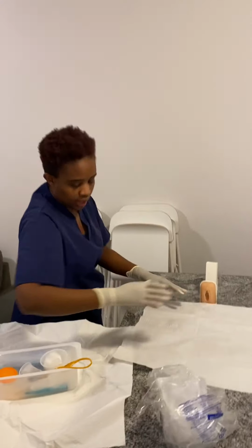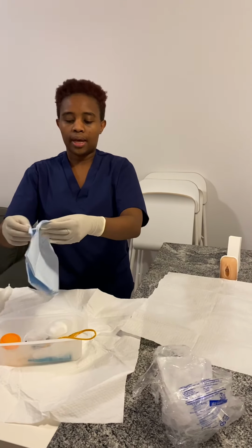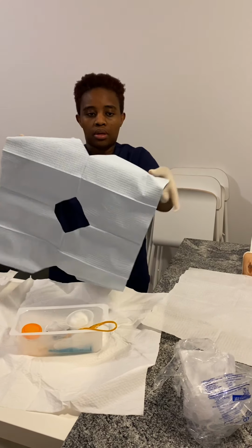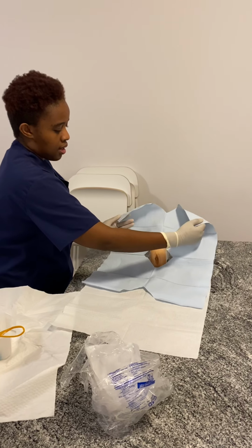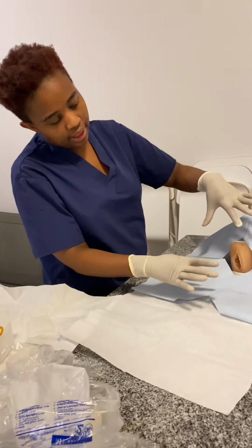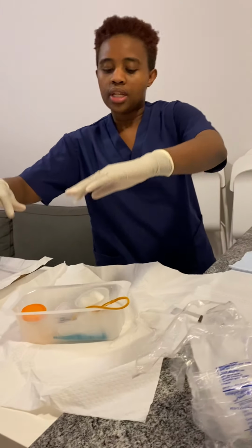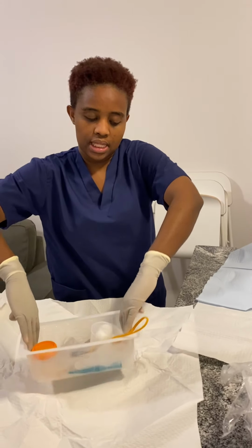Okay. And then I'm going to use the fenestrated drape, and I'm going to put it on top. Again, I have to make sure that the shiny part goes on the bottom. I have to make sure that I have a good view of where I'm going to insert the catheter. So what I'm going to do next, I'm going to take my tray, and I'm going to hold it like this.